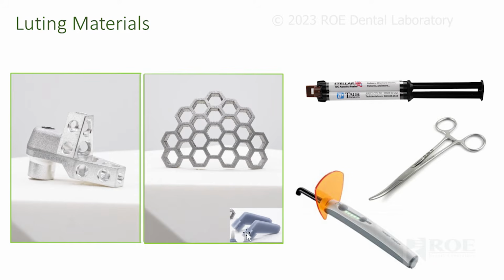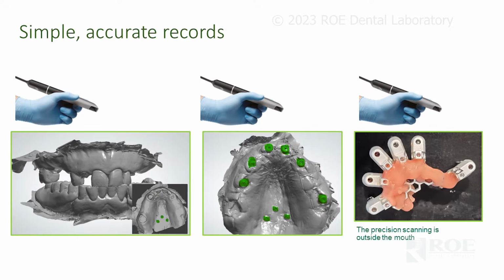I mean, they have a little frame here, but sometimes these break, so I have those. And a curing light. That's about all you need. Some luting materials, and you need a driver to put the screw in. But what you need chairside is very limited to perform the luting process. So this is just a little summary because we're going to go into the details.